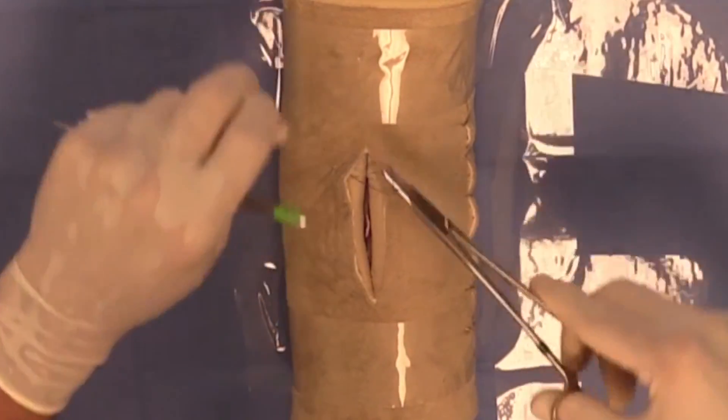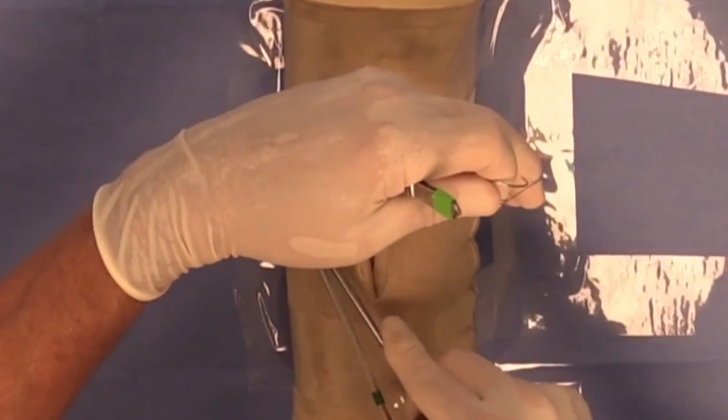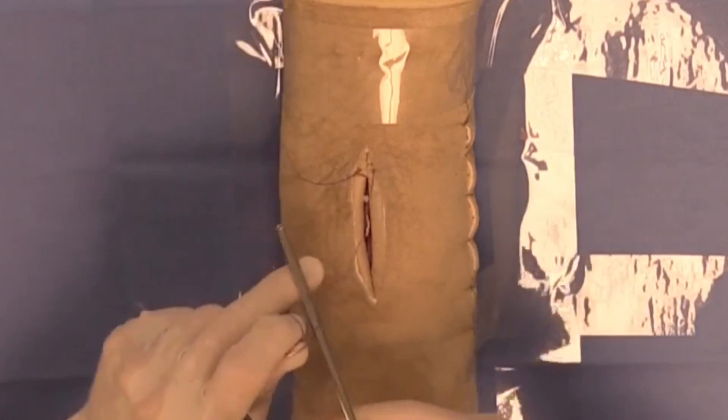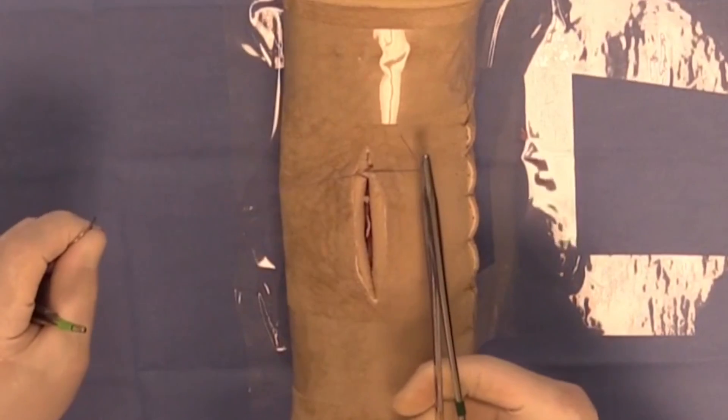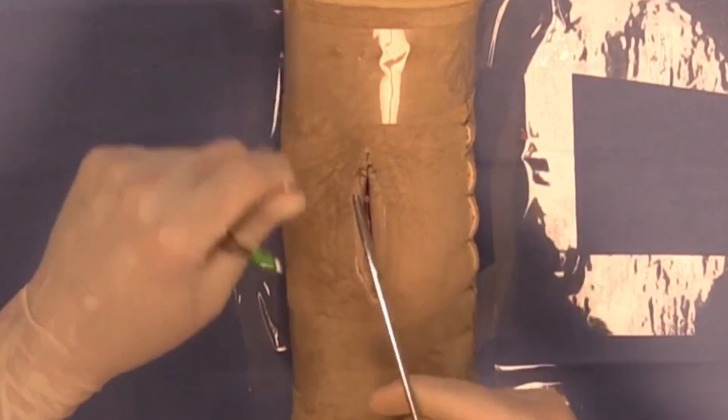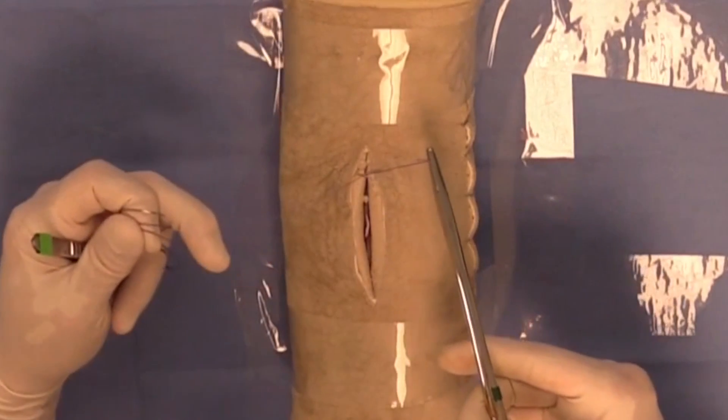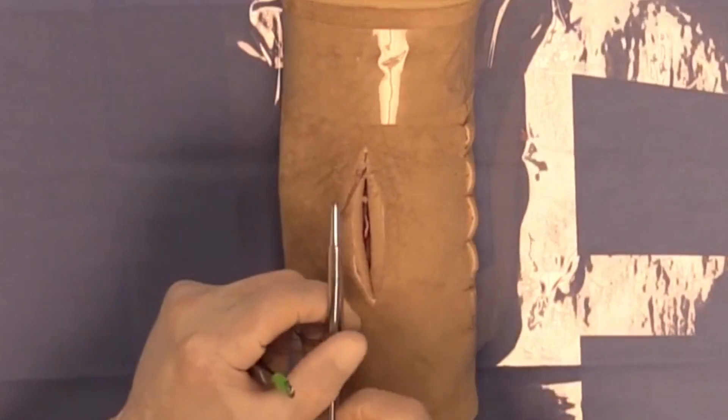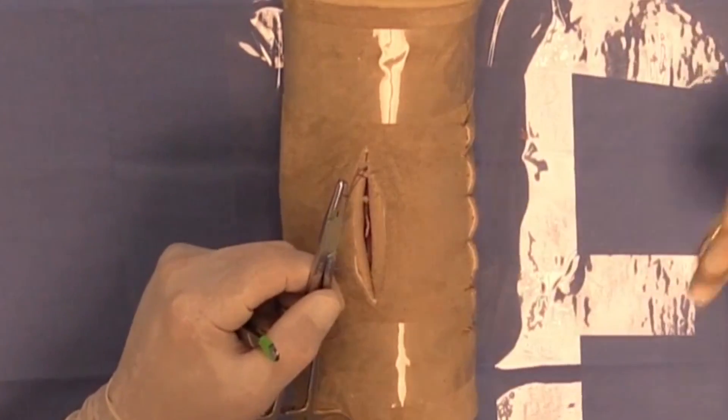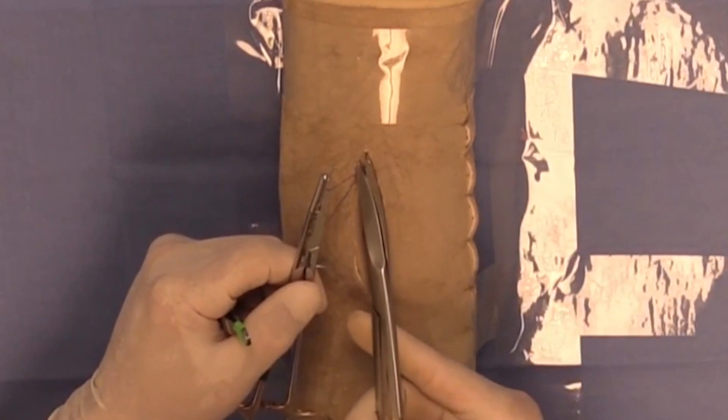One of the issues that you will face in life with this suture pattern is that depending on how close your knot is or your suture bite is to the skin edge, you might expose your knot.